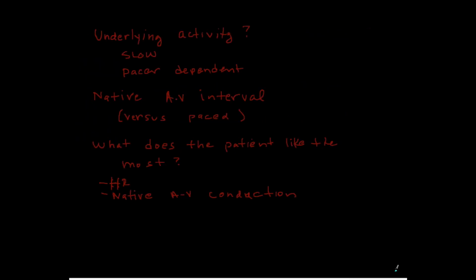Okay, so to summarize, hopefully the scenarios that we talked about cover some of the adjustments and settings that you will make on the pacemaker, and in doing so, really get to the core things that are important in assessing these patients and assessing their needs relative to the pacemaker.